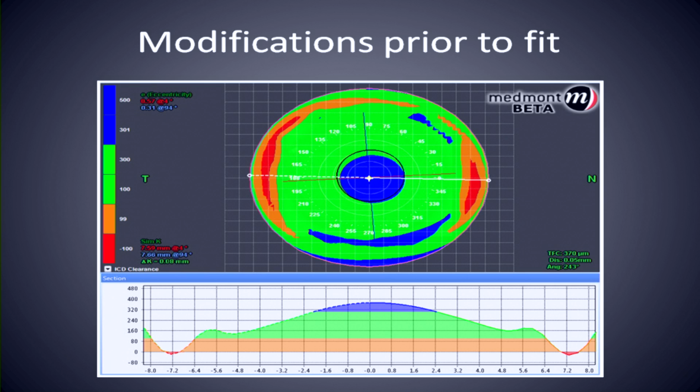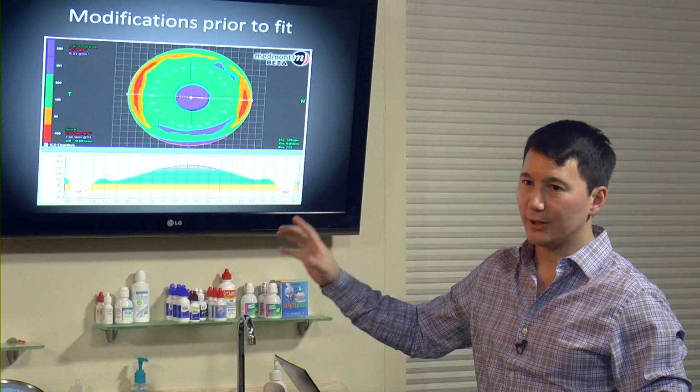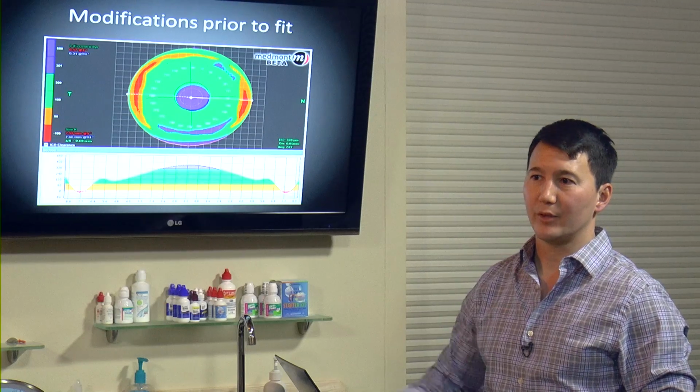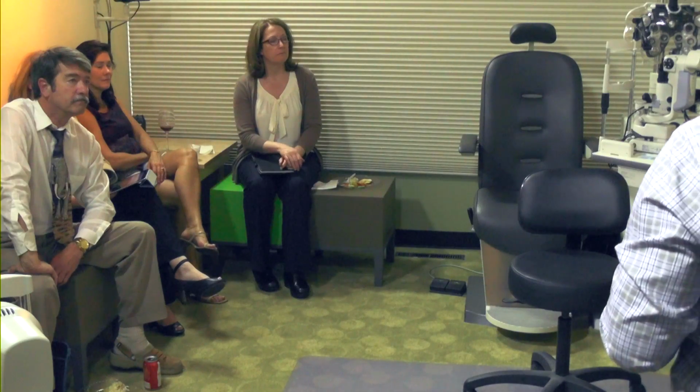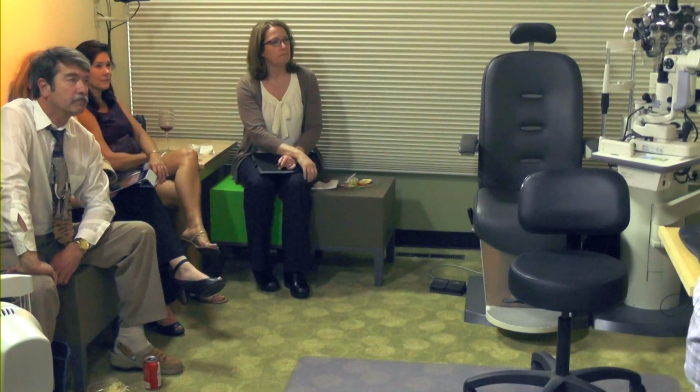So we're kind of excited that maybe a corneal topographer that measures cornea could actually be used in a similar manner to how we select our initial corneal GP lenses. This needs to be proven out. It's very new, and we're presently at Pacific testing this nomogram to see if it actually works. But if it does, wow, do we have a powerful tool for selecting the initial scleral lenses.